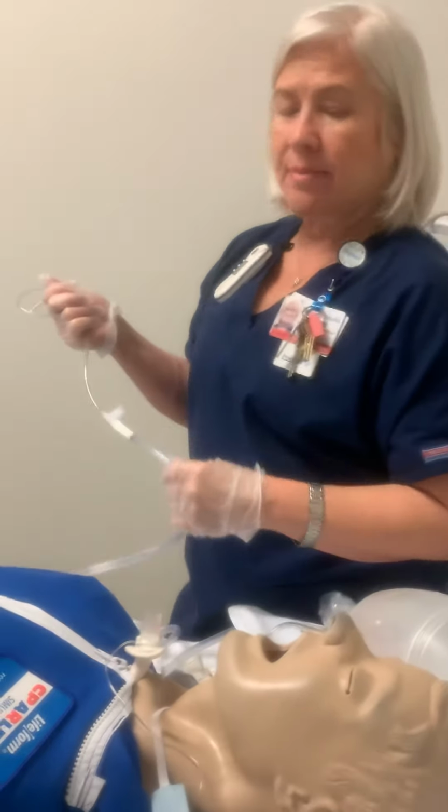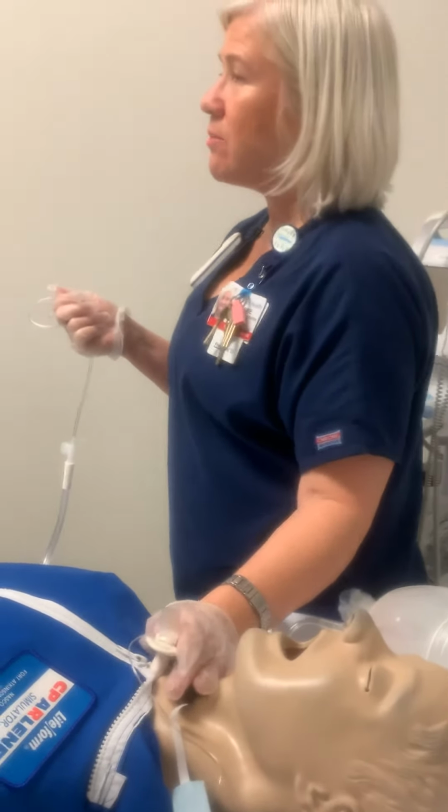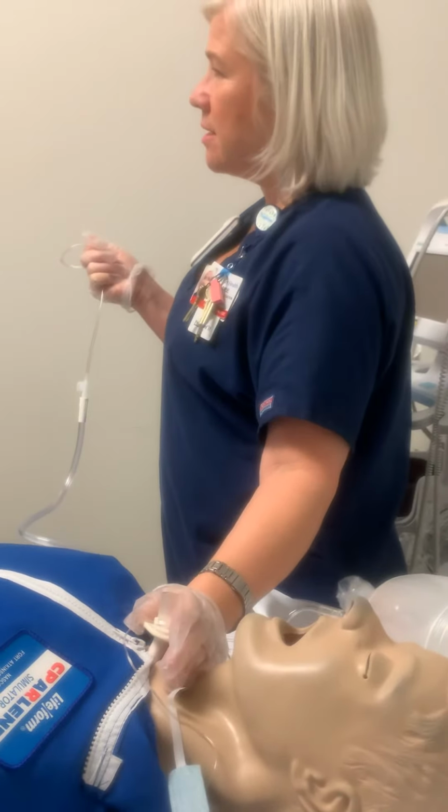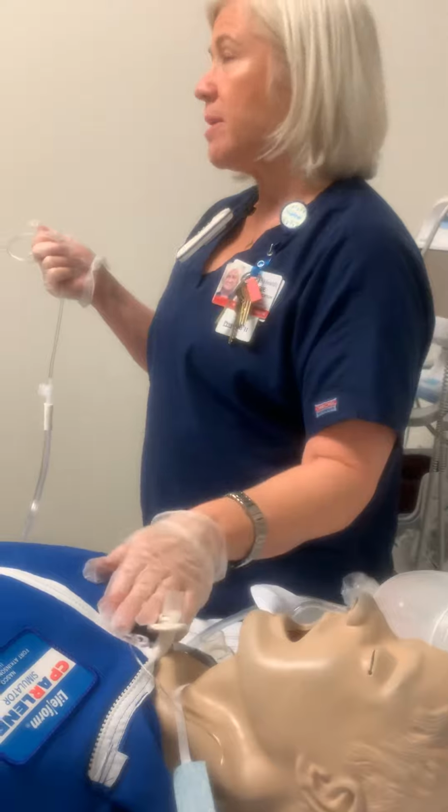So anyway, any questions on the suctioning? What's the max I can put this at? 150. Okay, and how long do I stay in? 15 seconds. And do I apply suction as I'm entering the trach? No.